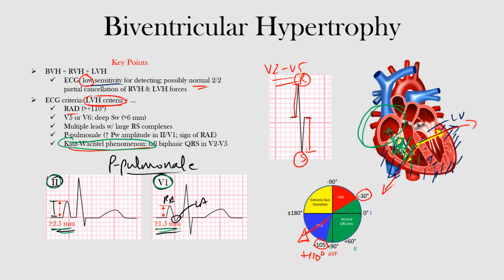You can see them. Well, that's the end of this lecture. We discussed the EKG features of biventricular hypertrophy. I hope you learned something.